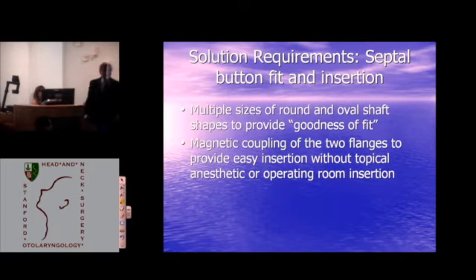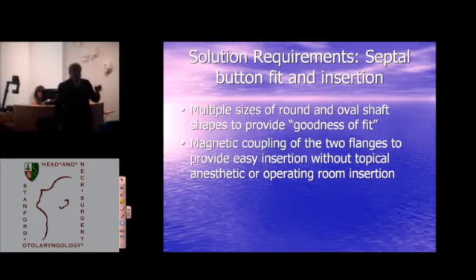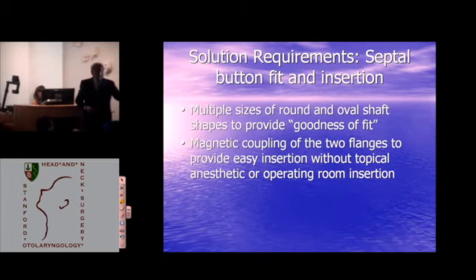And you know what I found emerged after probably 500 or 600 of these? They said, make me one that is the exact shape and the exact size of the perforation. And I did, as a one-piece device, and I had a way to do that. Well, what came out after making all those devices is you really only have two shapes to perforations, oval or round. There's not jaggedy stuff like this. And the ovals start small, round, and they become oval over time. I don't know why.